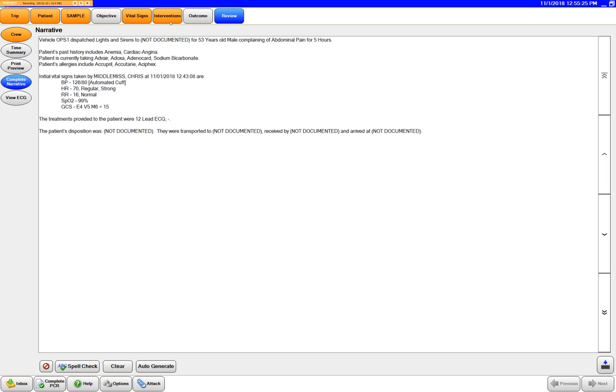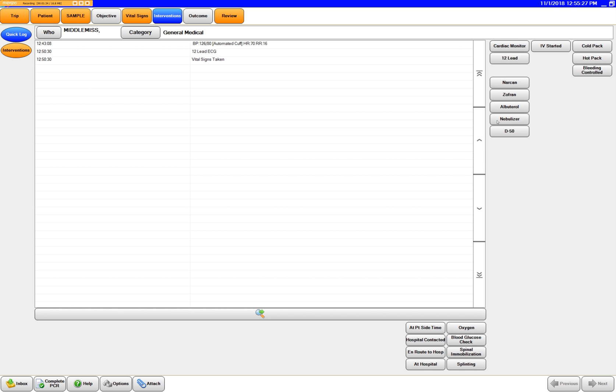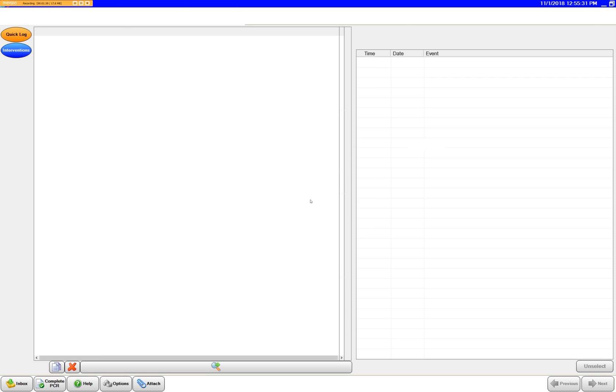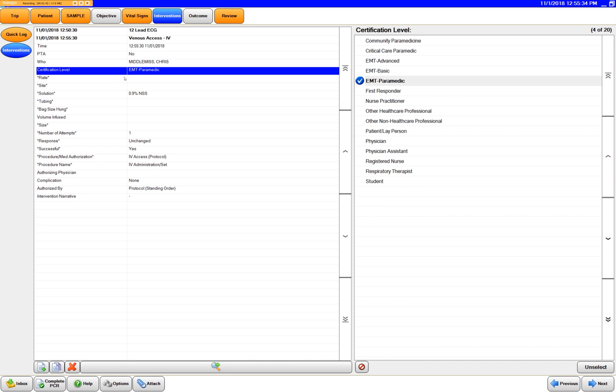So let's say we start an IV en route. You just go over here, you can start an IV.